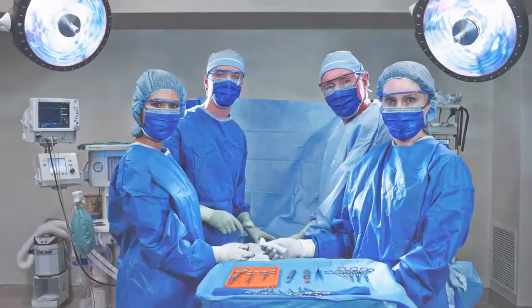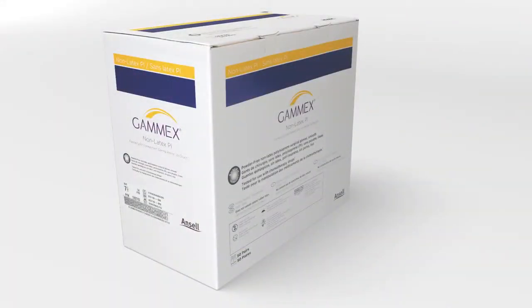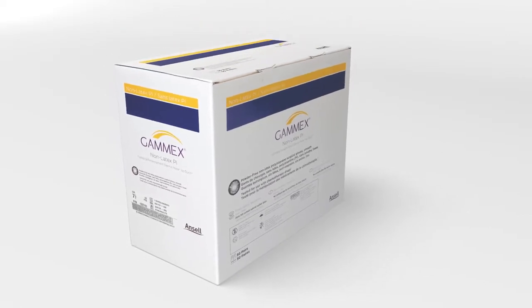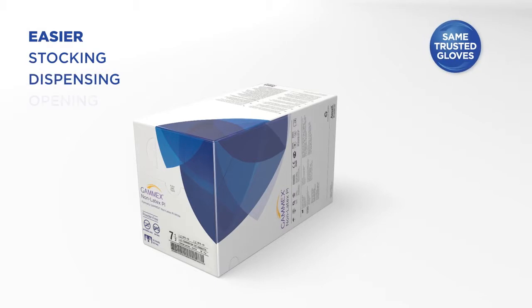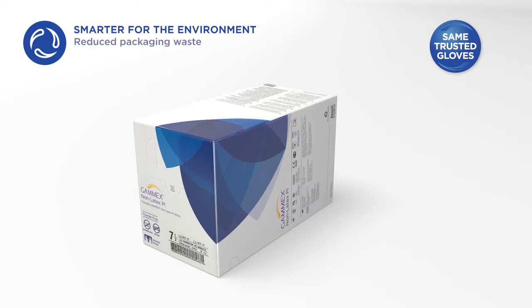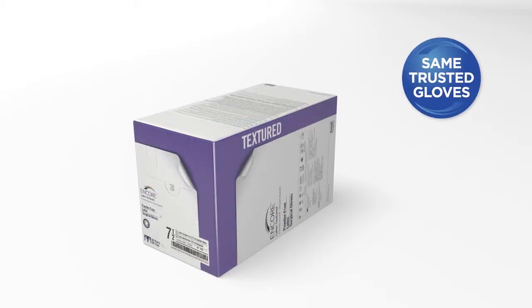Through end users' feedback, we looked at what we could improve in our old packaging, and came up with our new SmartPak — designed with innovations that will make stocking, dispensing, and opening gloves easier and safer in the OR. Even the overall environmental impact is reduced, but more importantly, the superior quality of your Ancel gloves remains unchanged.